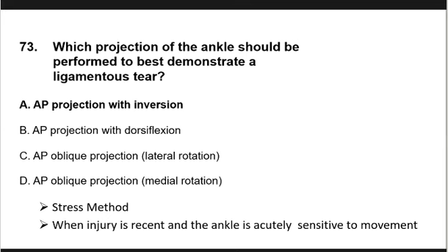To demonstrate the ligament tear or rupture or ligamentous tear, yan, AP projection with inversion, wherein the ankle is rotated inward, or that is what we call the stress method.